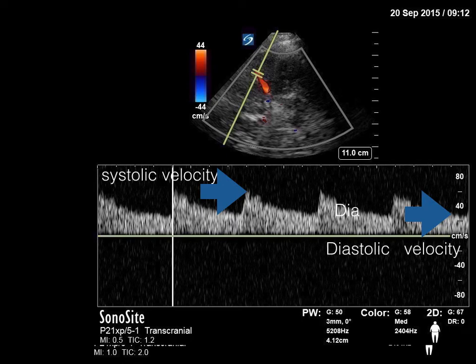Now, if the velocity is increasing, then what are the other things we can diagnose? Like in sickle cell disease, when the patient is going to stroke out, his velocity goes very high. You monitor every month once, and you see if they are ranging above normal. Their normal blood flow would be around 100, 150. Now when they reach around 200, 250, that means there is a lot of sickling happening. You have to transfuse a unit or two or treat with IV fluids or whatever, so that they should not stroke out.